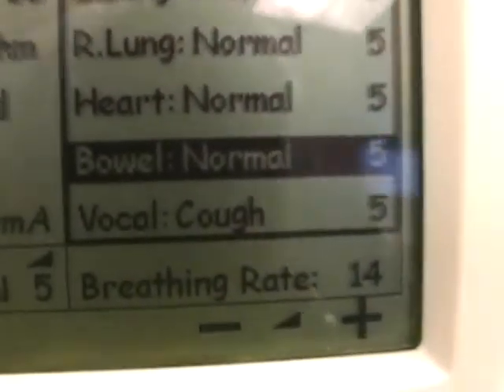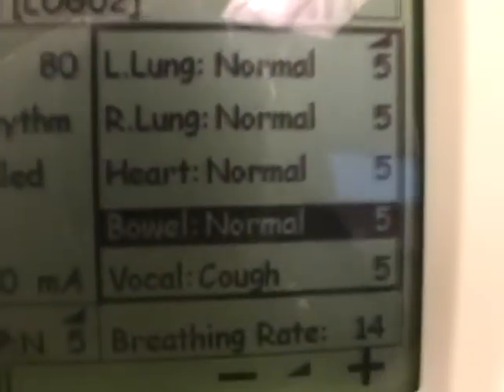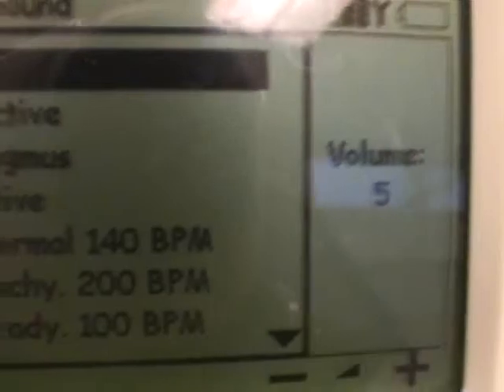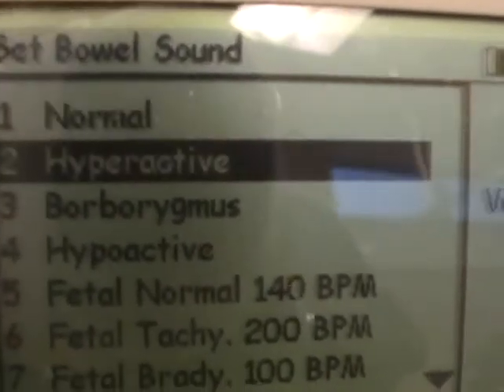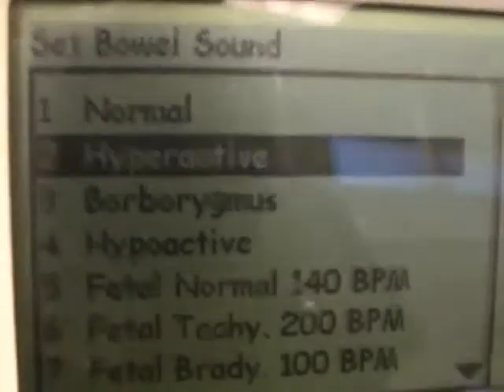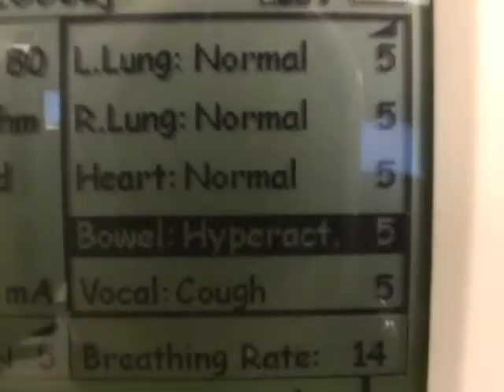So let's say we want to change that. Press the OK button while bowels is highlighted and choose whatever you want. Say you want them hyperactive — click OK. Now you've got hyperactive bowel sounds.